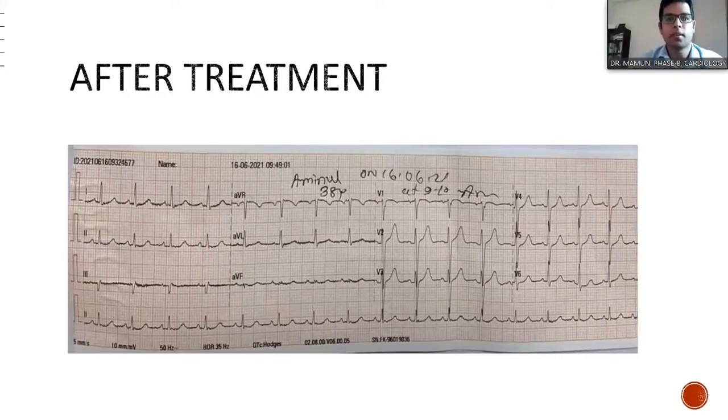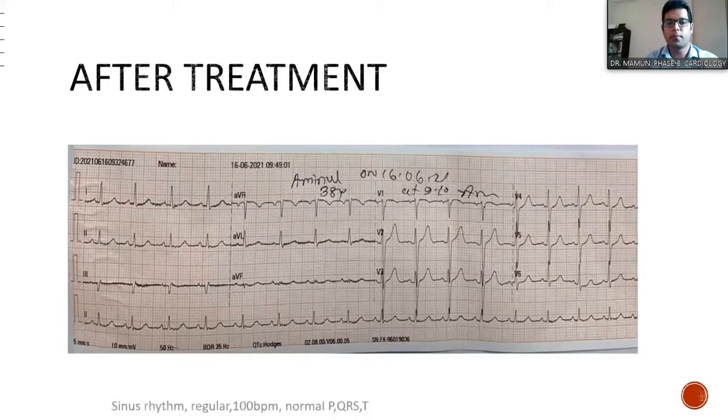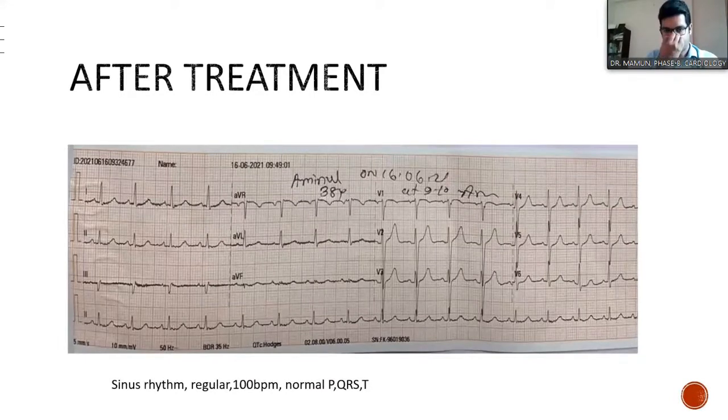After getting treatment, in the next morning, this is the patient's ECG. It shows the patient has reverted to sinus rhythm. Reduction of the peaking of T wave, and QRS is also getting normal.